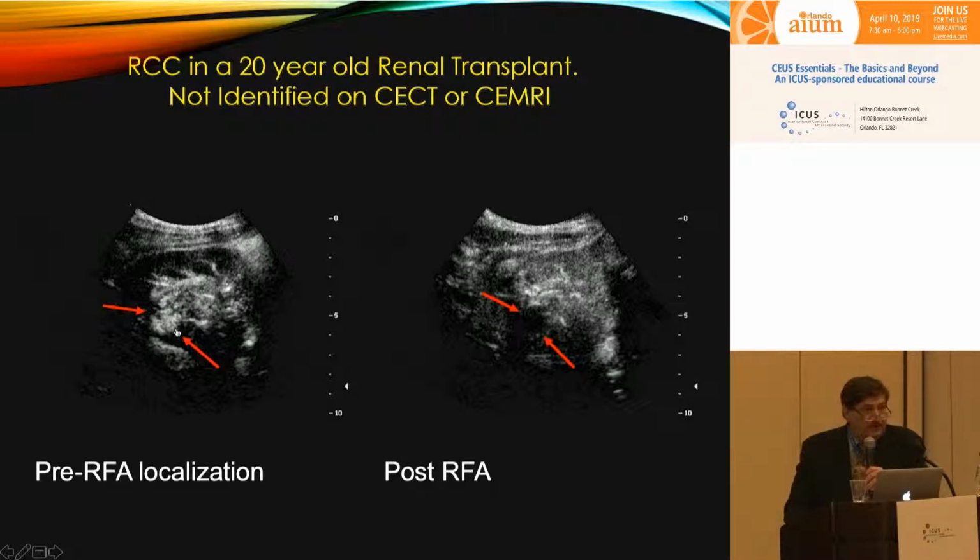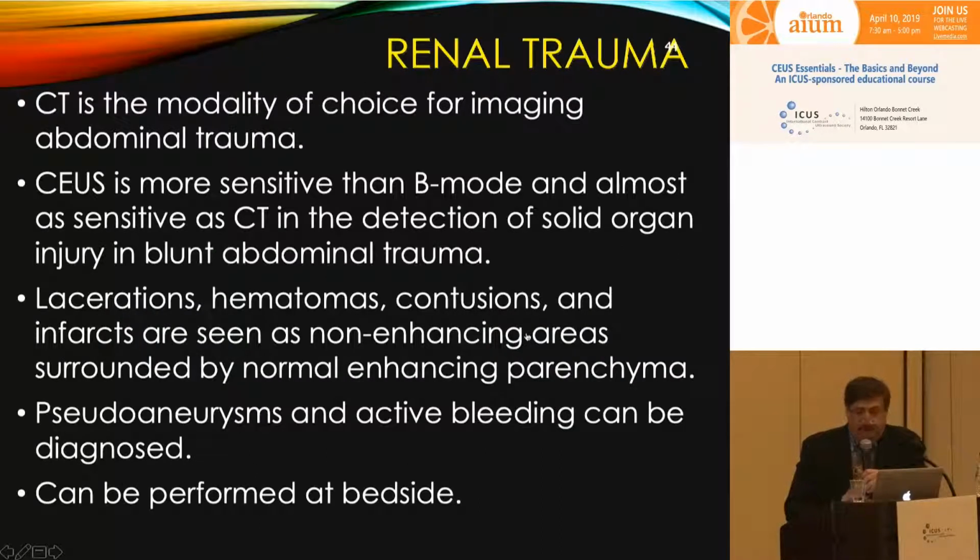We biopsied under ultrasound contrast. It was a renal cell carcinoma, and then we went ahead and ablated it with ultrasound contrast guidance. And again, here you can see post-ablation, there's no bubbles in the lesion. So again, you only need 1 or 2 of these cases for urologists to realize the significant improvement we can provide them in clinical care of their patients.